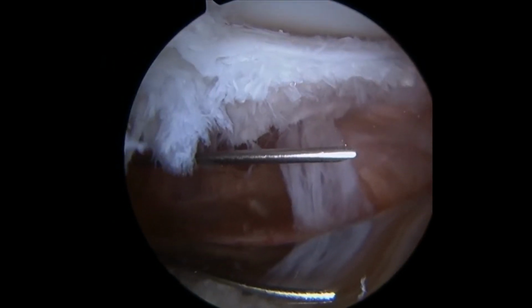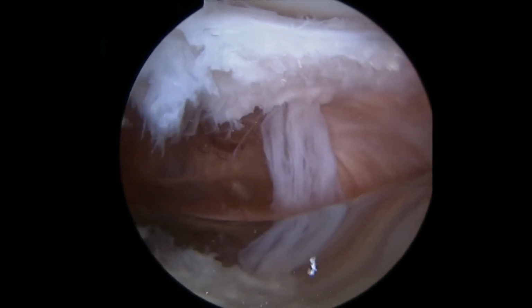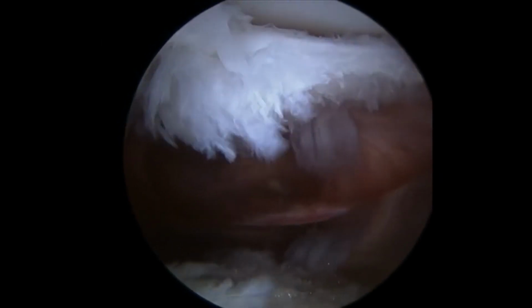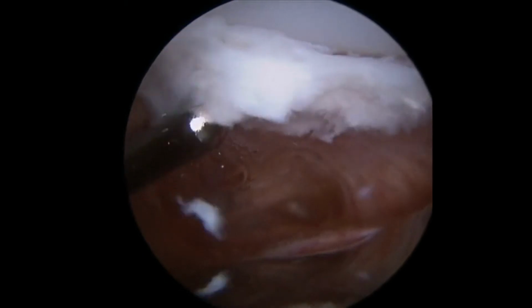This is where now this needle is coming in to the top of the patella, so I'm making another portal. The portals are what we use to go in with the camera and tools, and the portals are like 5 millimeters just to accommodate that camera. So first we localize it with a spinal needle, so that's a long needle. And so I localize it. Now here comes the tool. Now this is the problem area right here. So this is what we cleaned up.